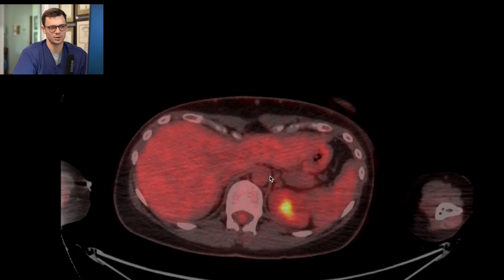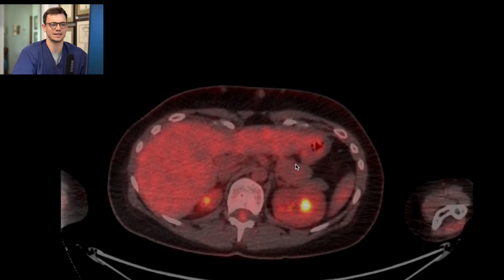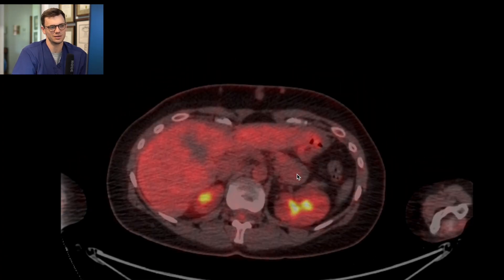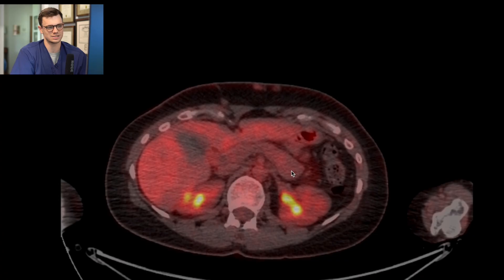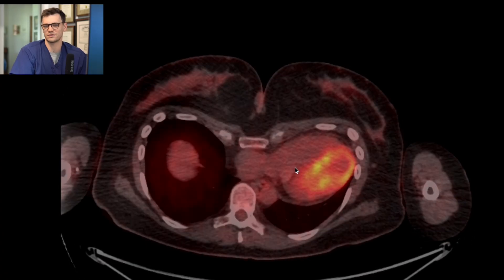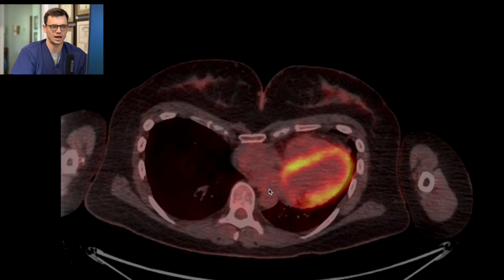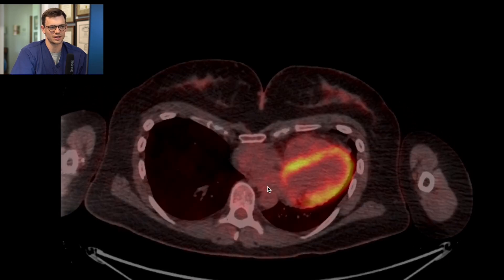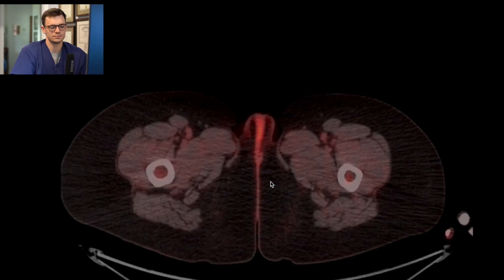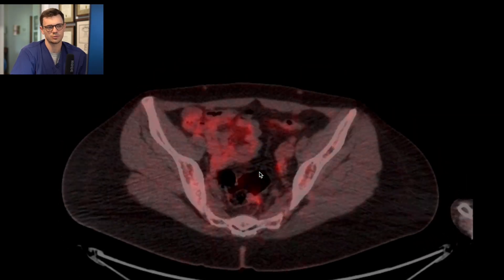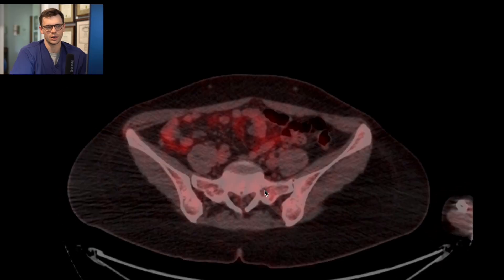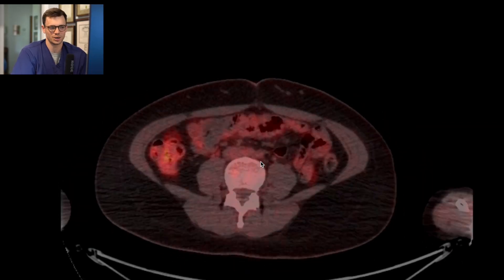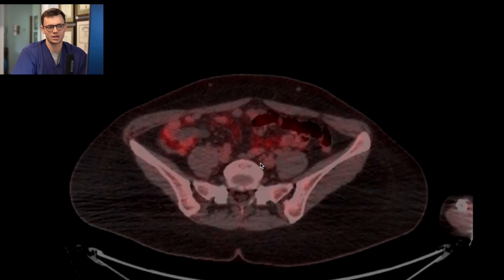Then try to look at the small bowel and stomach. There are different inflammatory processes that can show increased activity. If you see a lot of increased tracer in the stomach, that doesn't necessarily mean stomach cancer — it could just be gastritis. Same with the esophagus. People that have esophageal reflux and esophagitis have an esophagus that looks a little hot. The esophagus here looks normal, though it's kind of hard to delineate from the aorta and the rest of the mediastinum. After that, I cover the body wall and soft tissues, making sure there's not some odd hot spot on the skin such as melanoma — melanoma can be very hot. Body wall and skin all look okay.